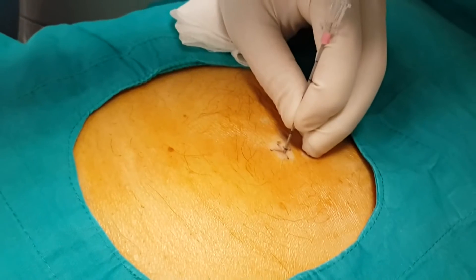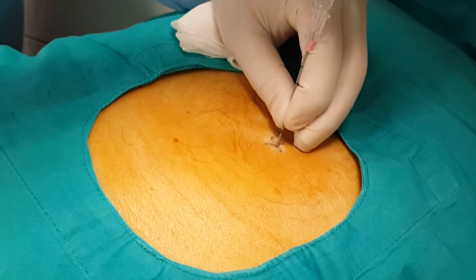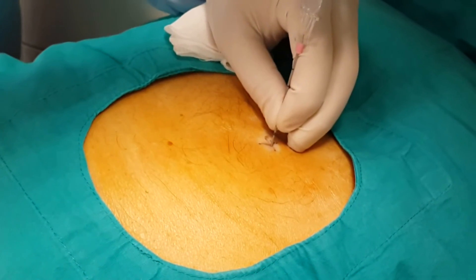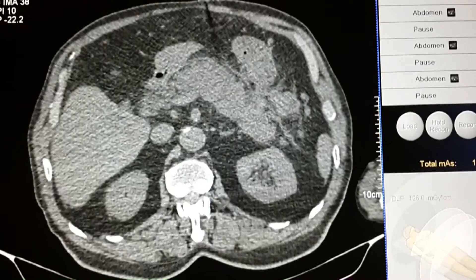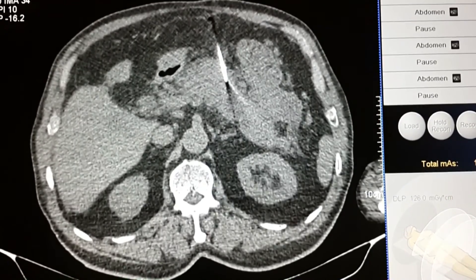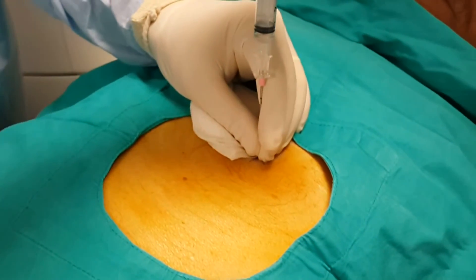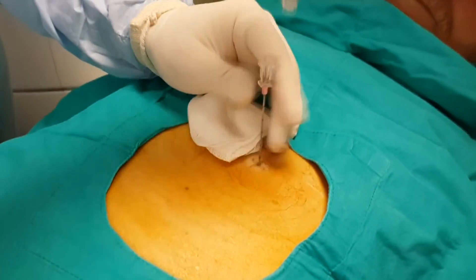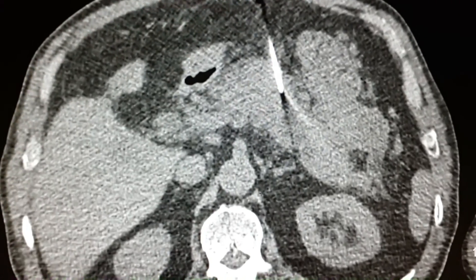After local anesthesia, we put the needle into the skin and advance it a few centimeters towards the mass. Then we make a CT run to see if the needle is going in the correct direction. We repeat this several times until the CT shows that the needle has reached the mass at the desired point.